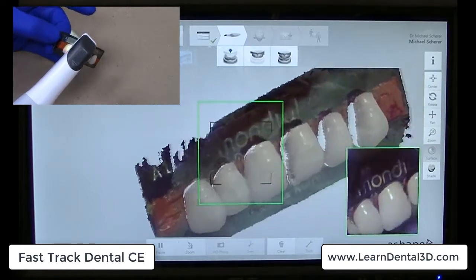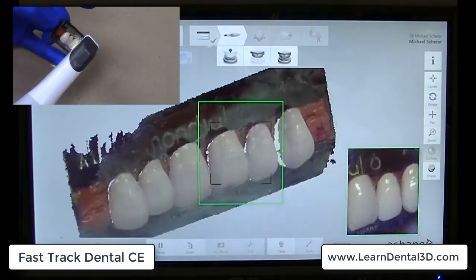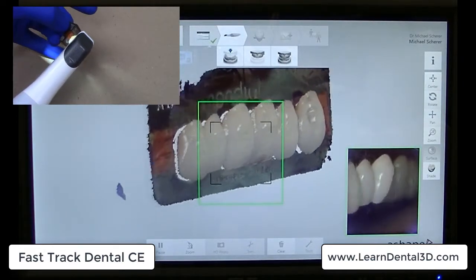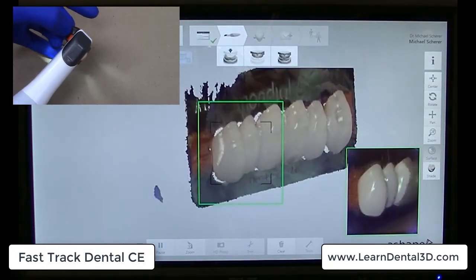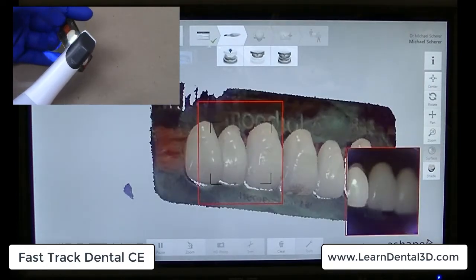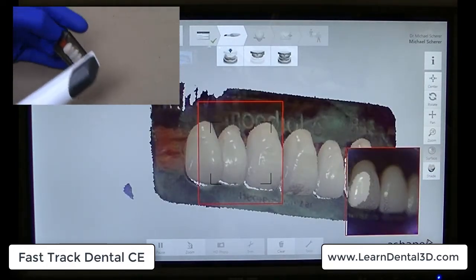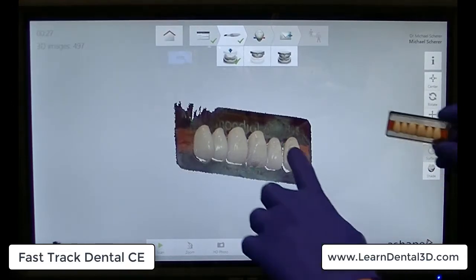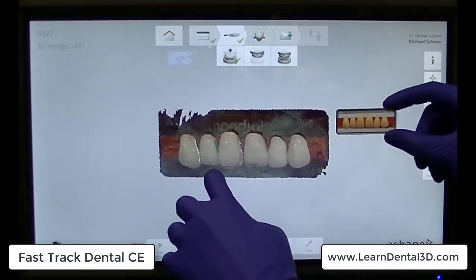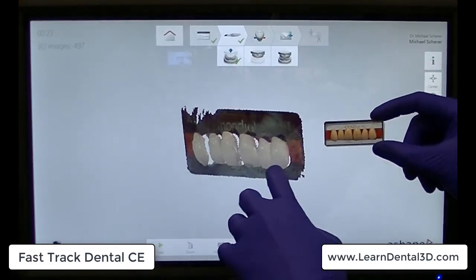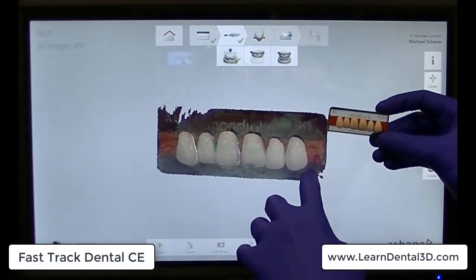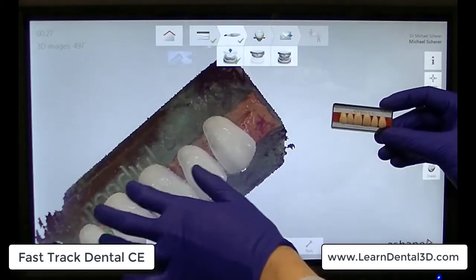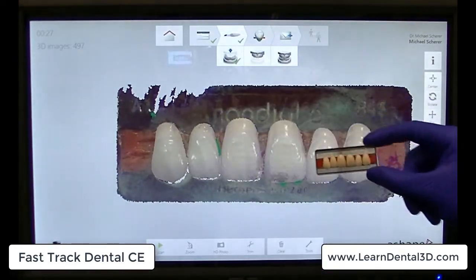Even though Trios is an intraoral scanner, you can see here I can use Trios extra-orally to do creative tasks, like easily scanning this entire denture tooth card in just a matter of less than 30 seconds. The fidelity of the capture of the denture tooth card scan with Trios is really pretty amazing.